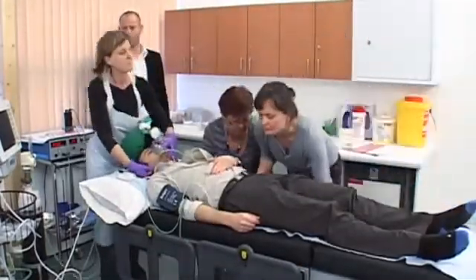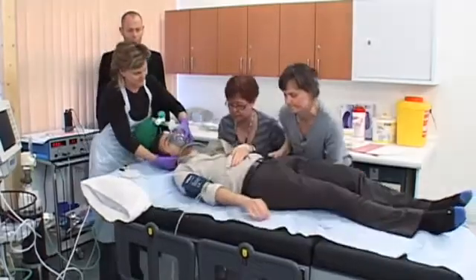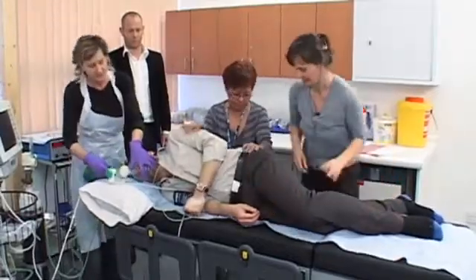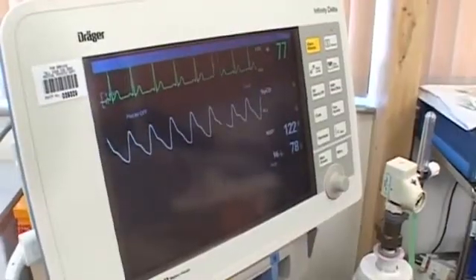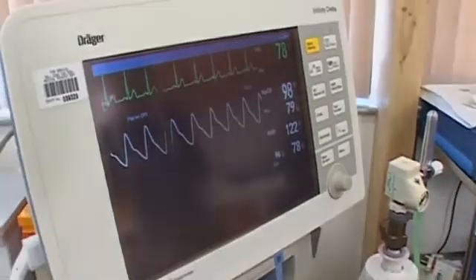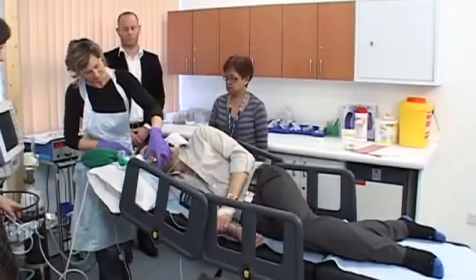After treatment, the patient continues to be monitored and is given more oxygen as they gradually wake up. Mental state should be assessed following each ECT session, and treatment should be stopped when symptoms improve and the patient starts making good recovery from the illness. Cognitive function should also be monitored on an ongoing basis and at the end of each course of treatment.